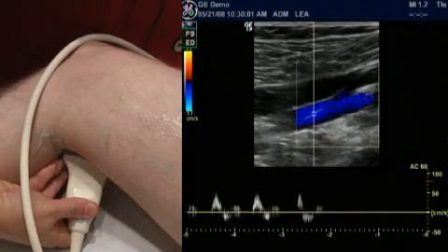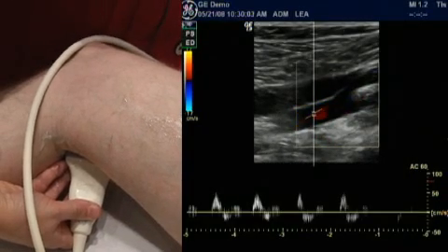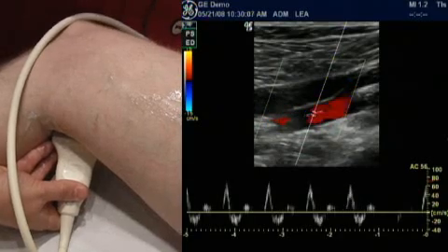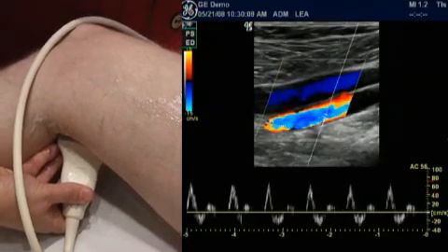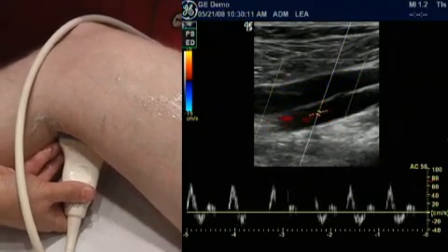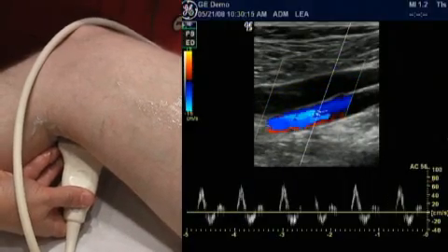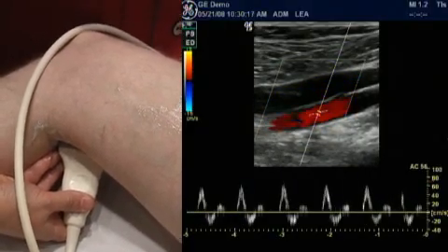And now here for our Doppler, we'll want to give us a little more angle. 60 degrees is perfect, but less than 60 is okay in here without having to fuss too much. I've adjusted it. Now I'm at 56 degrees.